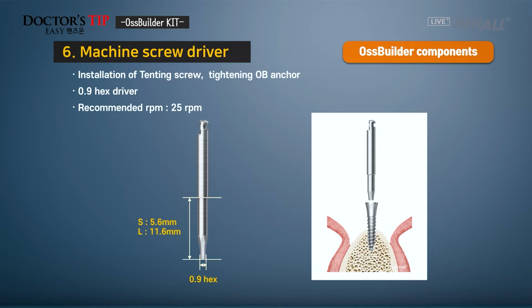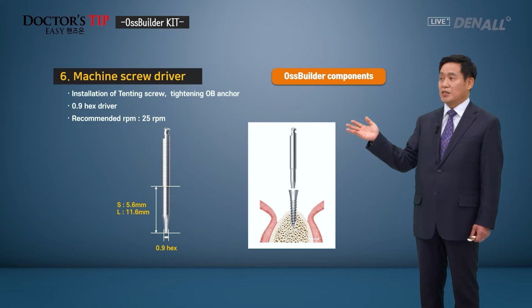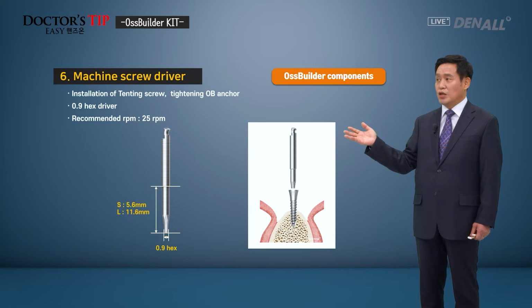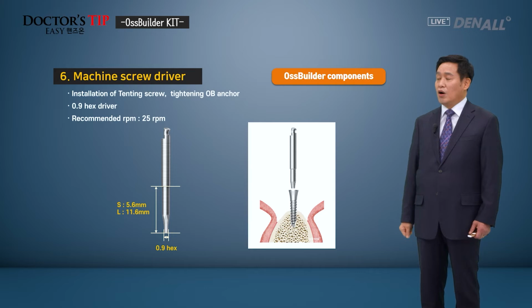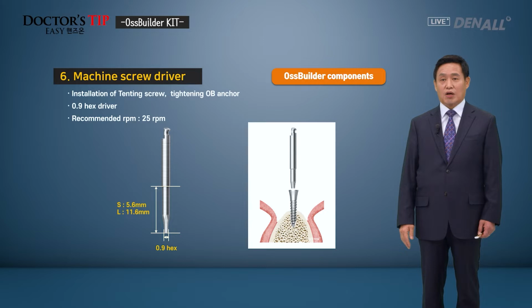Next is the machine screwdriver. This can be used to install the tenting screw and tighten the OB anchor. It is used with the engine, in other words, connected to the handpiece, and there's also a 0.9 hex driver without implant placement, and when you connect the tenting screw, you can use this. As mentioned earlier, you can use this for the OB anchor. The recommendation is approximately 25 RPM.